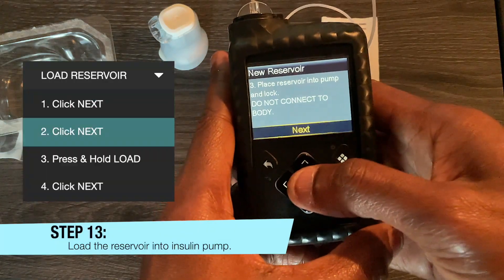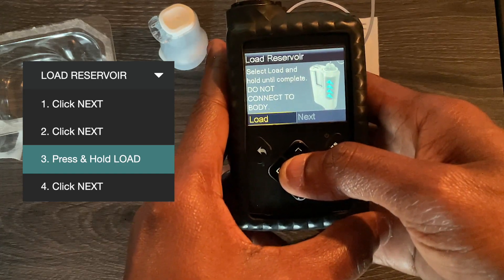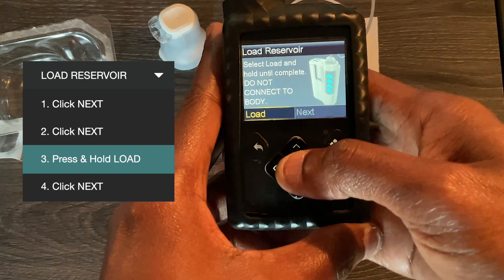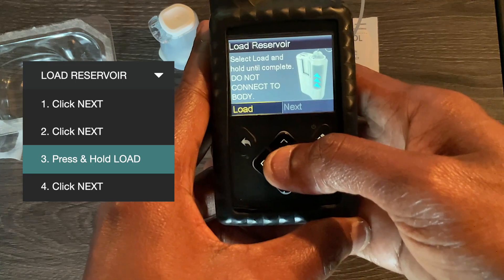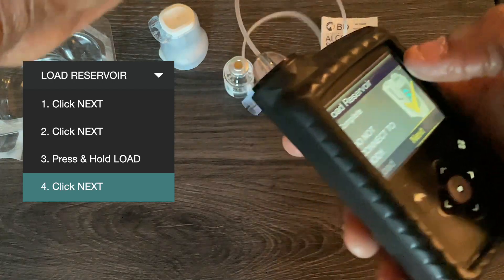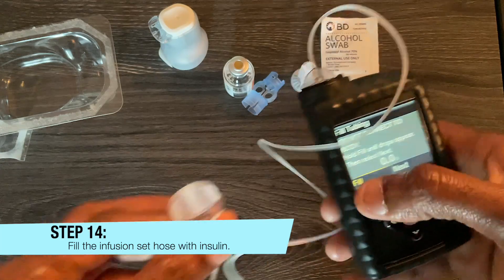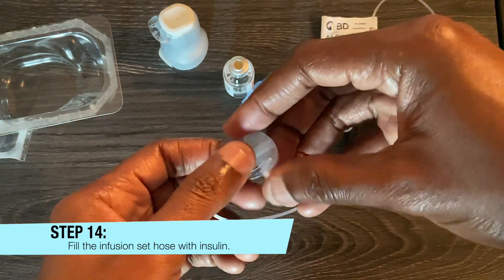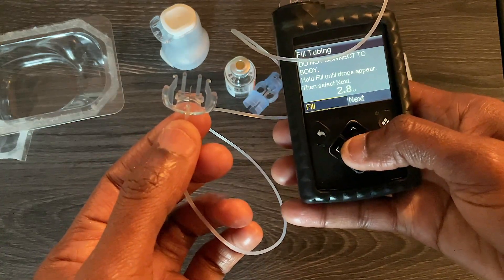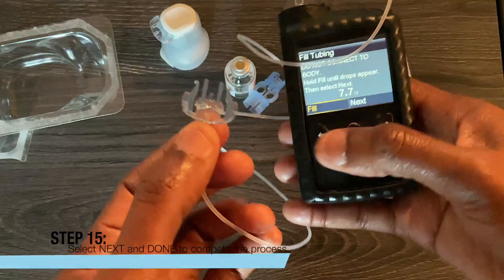Click Next, Next, Next, and then Load, and hold the button. You'll hear a sound that will let you know when it's finished loading. Once it's done, click Next. Now you need to fill your insulin tubing, so press and hold the button until you see some droplets of insulin coming out.